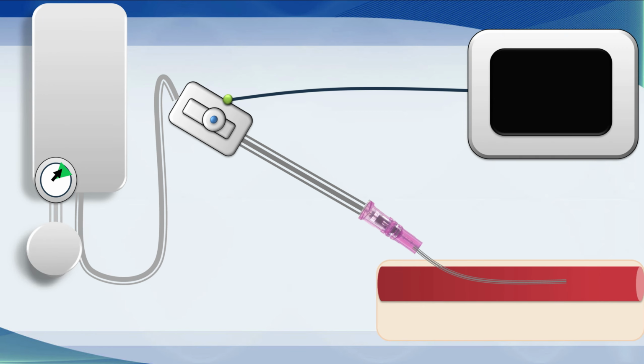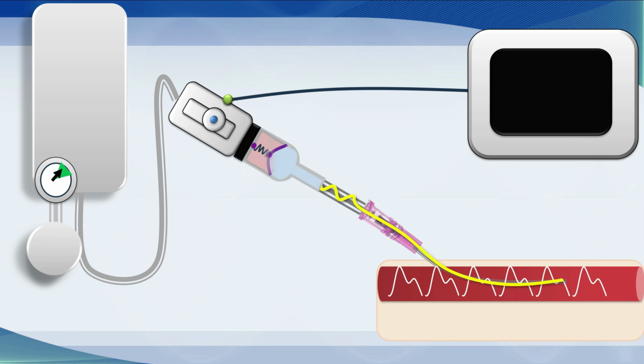Pressure waveform fluctuations in the artery are transmitted into the catheter and then into the saline-filled tubing that serves as a pressure column. The transducer is an electromanometer that works a bit like a drum. It's displaced by the pressure fluctuations, then sensed electronically, and a digital signal is constructed from these data for display on the screen.